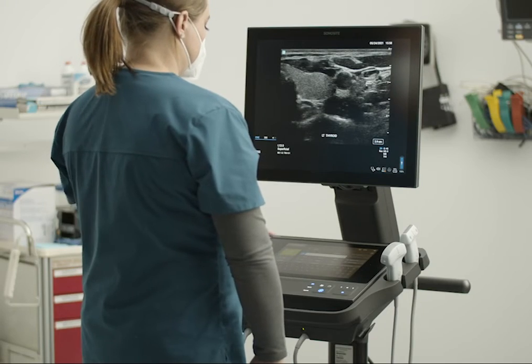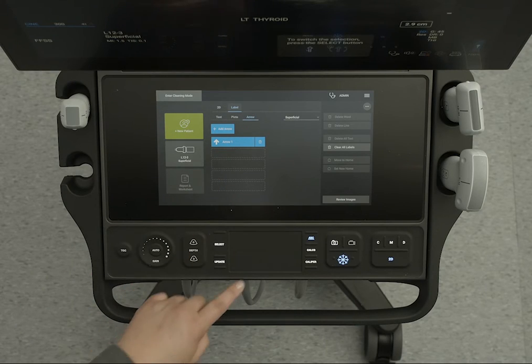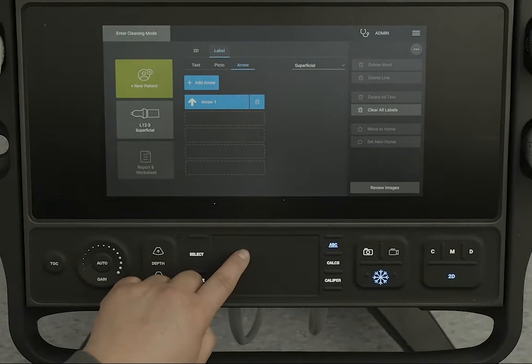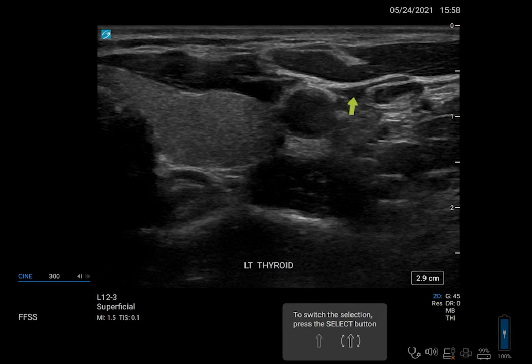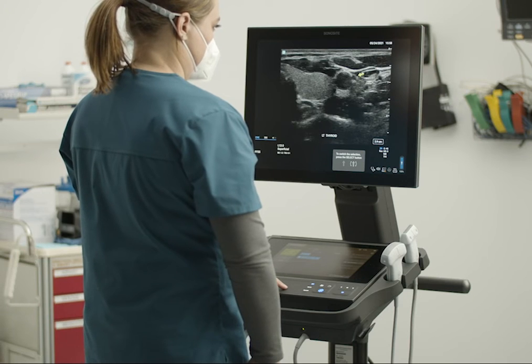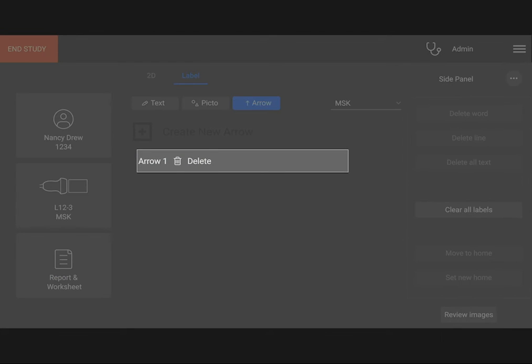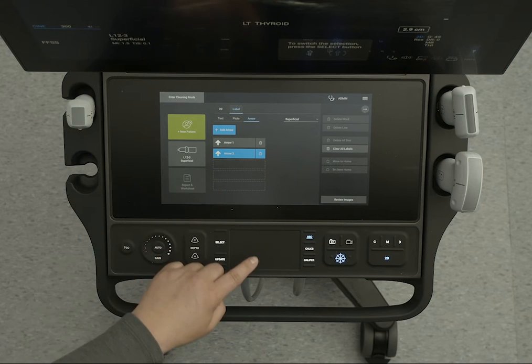Now let's add an arrow. Press Select again if you want to move the arrow. If you want, rotate the arrow by pressing the Select button and dragging your fingers on the touchpad. To delete the arrow, simply tap Delete on the touch panel.